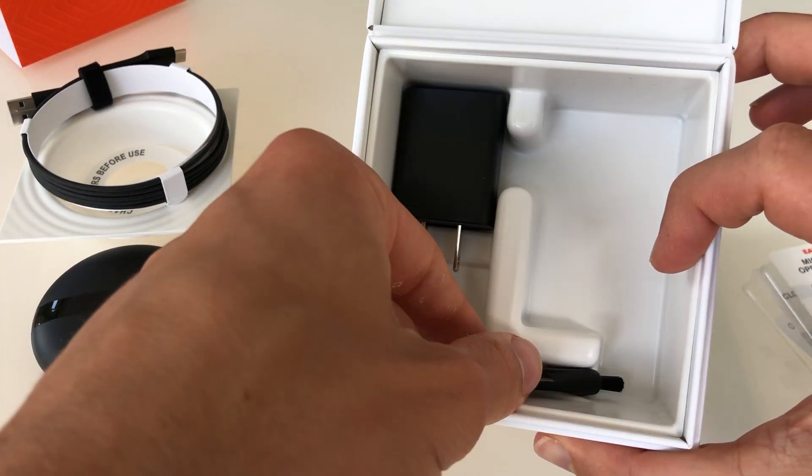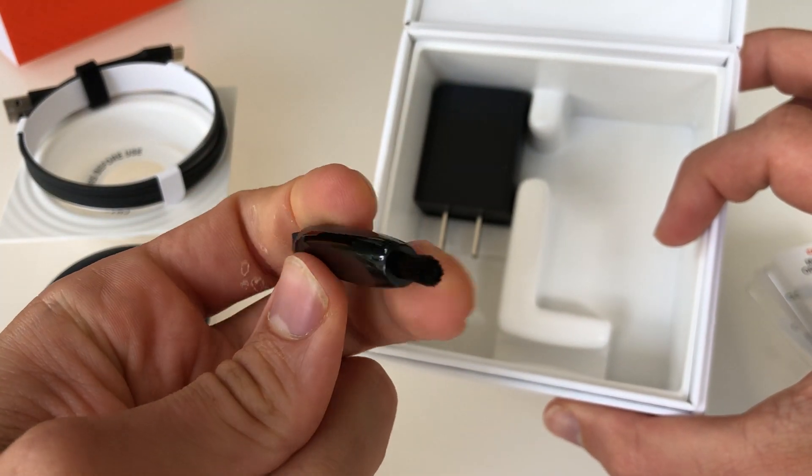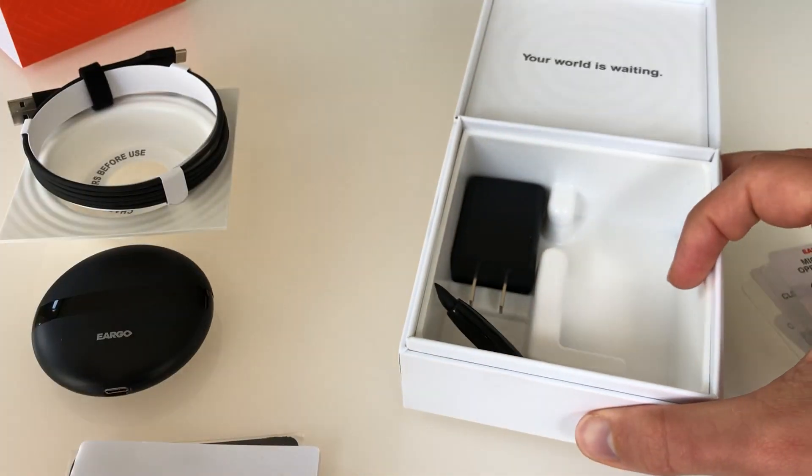Additionally, in the case, there's a cleaning tool and a brush, as well as the charging cable.